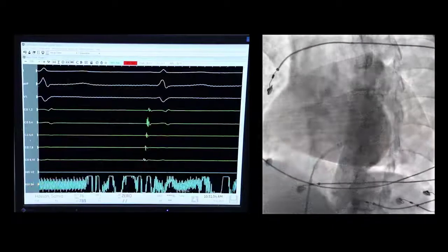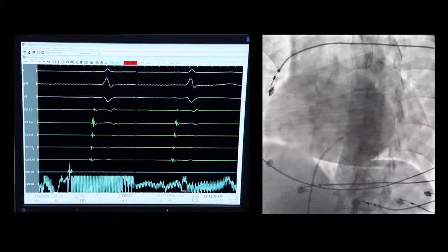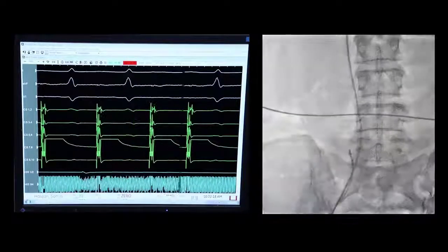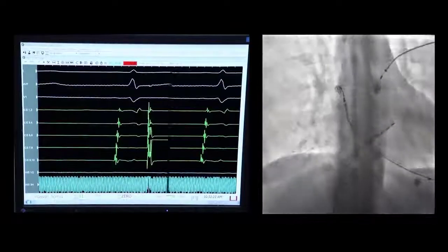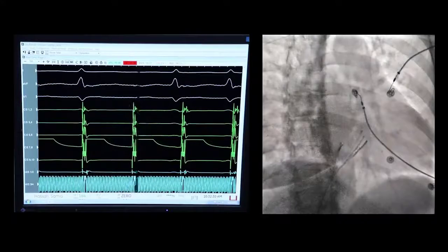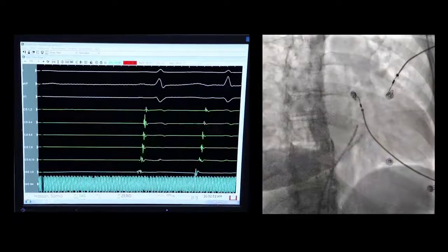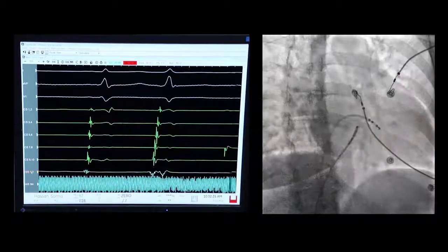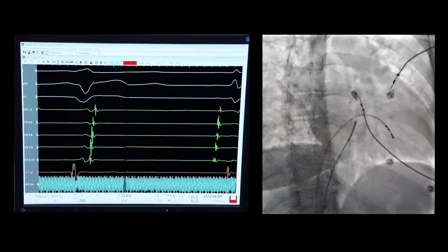Here the CS catheter is in the coronary sinus, and we can see the recording on the decapolar catheter, a sharp A and far-field V. Here the decapolar catheter navigated in the right atrium and right ventricle and also the His region.